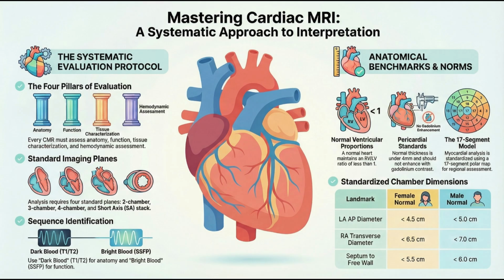It's a technique called double inversion recovery, or double IR. And without getting too bogged down in the physics of it, just think of it as a timing trick. You send a magnetic pulse that prepares everything in that slice of the heart. Then you wait a very specific amount of time. You're waiting for the blood to move. Exactly. You're waiting for that tagged blood to flow out of the slice and for new, fresh blood to flow in. Then you snap the picture, and the new blood, because it hasn't been prepped, gives no signal, so it just appears black. The muscle, which stayed put, gives a signal. It's basically a motion filter. That's a great way to think about it.